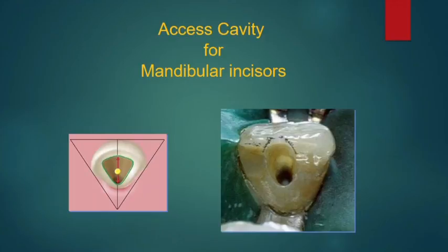Now, sometimes when we have a limited access, this will impede the instrument from getting into the lingual canal. So, removal of the coronal obstacle is required to have an adequate access cavity so the file can enter the lingual canal easily.